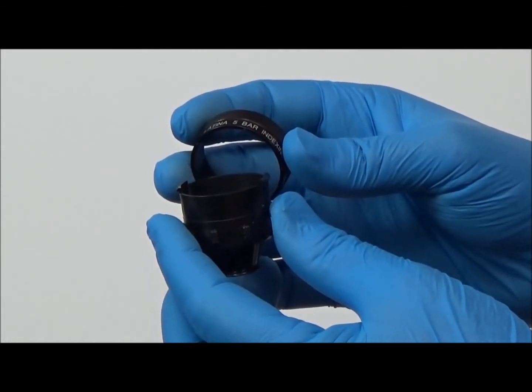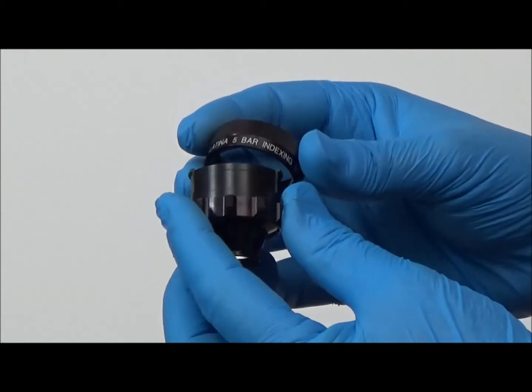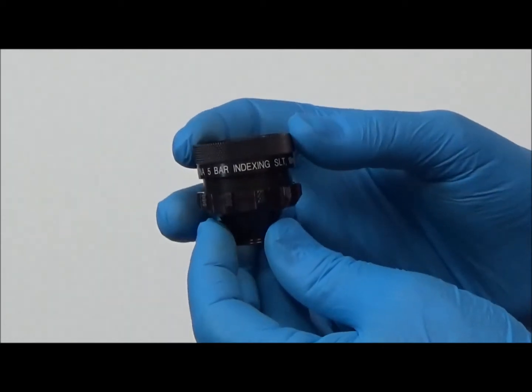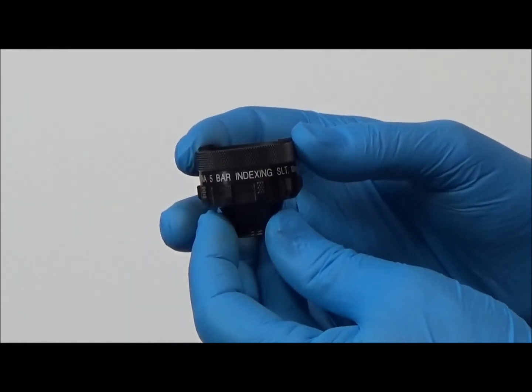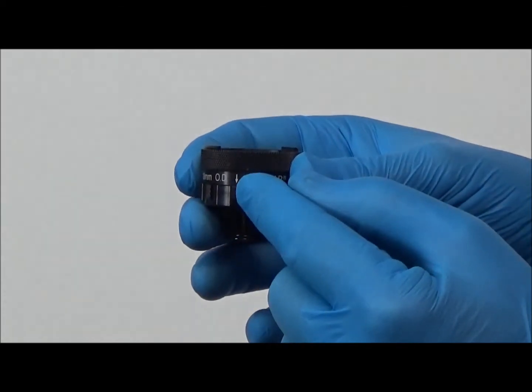To reassemble, simply slide the knurled rim over the tabs until it clicks into place. Note the direction of the arrows on the rim when reassembling. The arrows should point to the lens when reassembled.